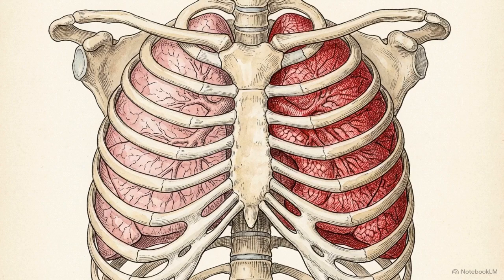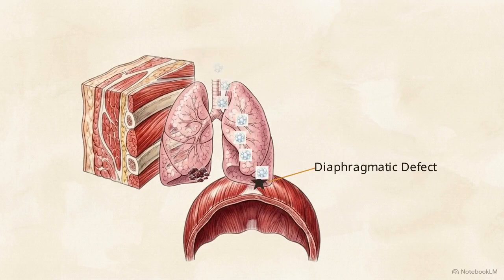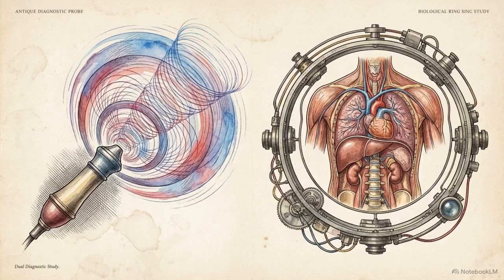Once the physical state of air is confirmed, CT imaging becomes necessary to evaluate the underlying causes in the lung parenchyma. For instance, a catamenial pneumothorax in thoracic endometriosis requires CT to map structural damage caused by endometrial tissue bleeding into the thoracic cavity. In air-based states, ultrasound provides the dynamic confirmation, while CT identifies the underlying anatomical cause.